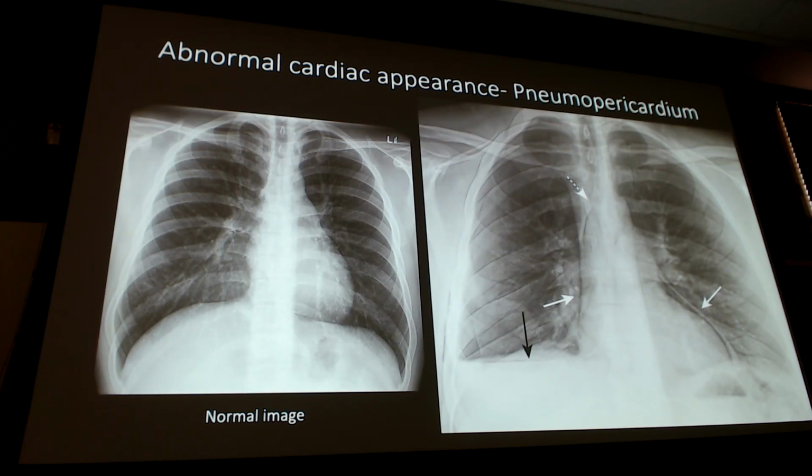Do y'all see the simultaneous pneumothorax on this film? I'm showing you. There's that one right there. And then let me look better, like you guys have the screen up.